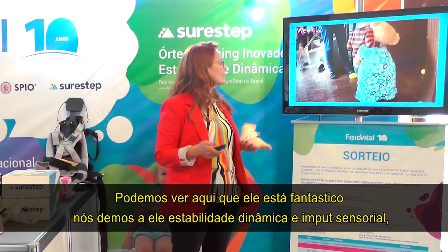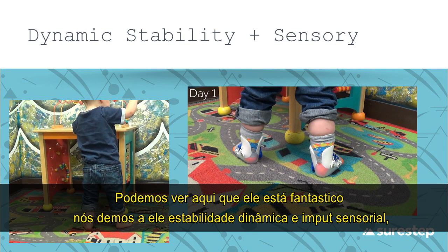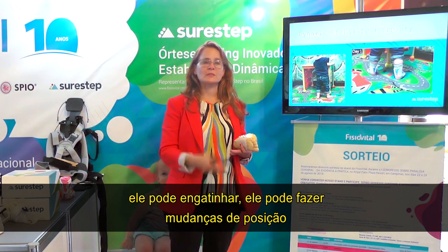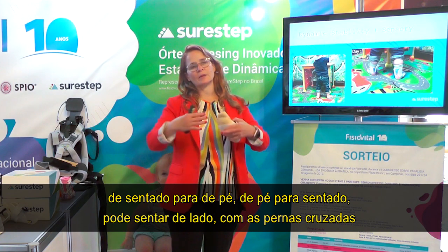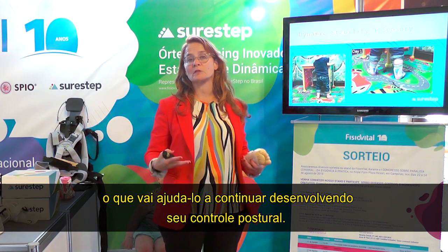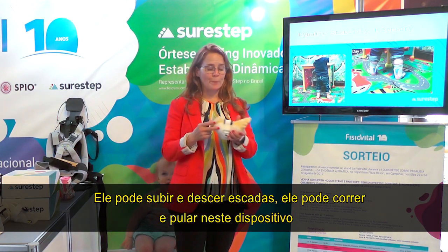We've given him dynamic stability and sensory input. We haven't impeded any of the movements he needs to do on the floor. He can crawl in these, go from sit to stand and stand to sit, side sit, and ring sit — he can sit in a variety of ways which will help him continue to develop his postural control. He can go up and down stairs, and he can run and jump in this device.